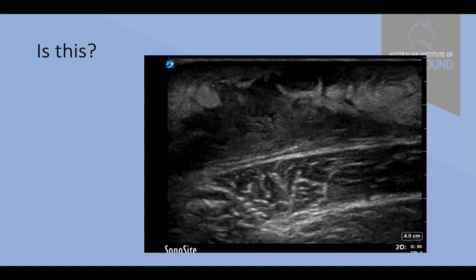Now I've put the straight probe down on an area of red skin. Obviously we're looking to see if it's just cellulitis or whether there's a collection. From the very top we have the skin, we have the subcutaneous tissue. These sort of white bits here are in fact inflamed fat, and the more inflamed they become, the brighter they become, and then they develop what almost looks like septations or dark cobblestoning of edema or lymphatics.